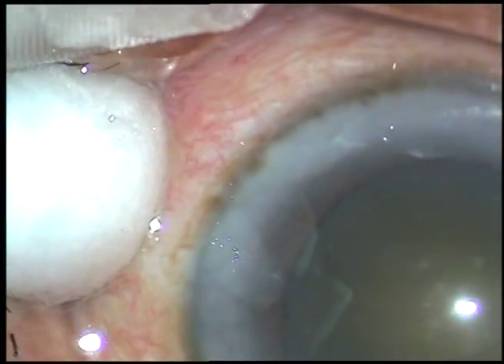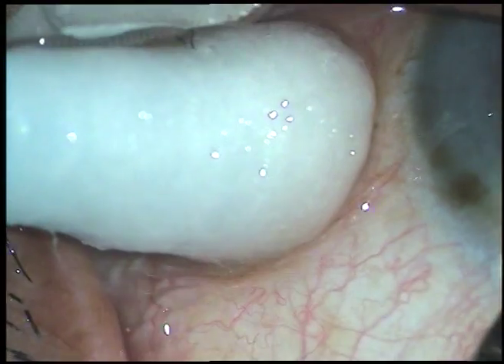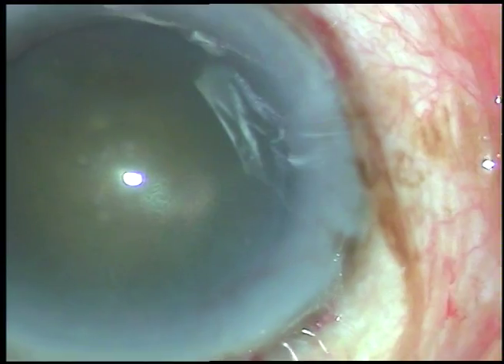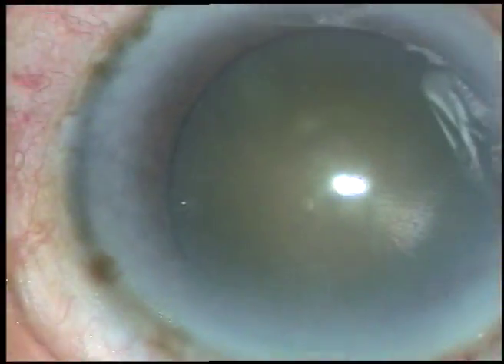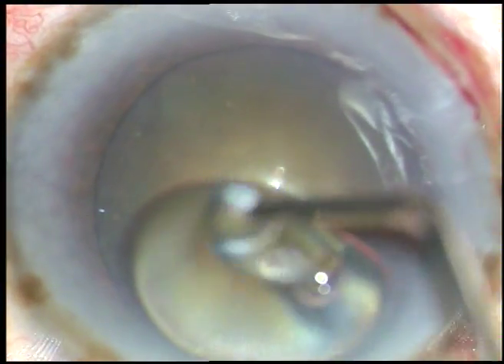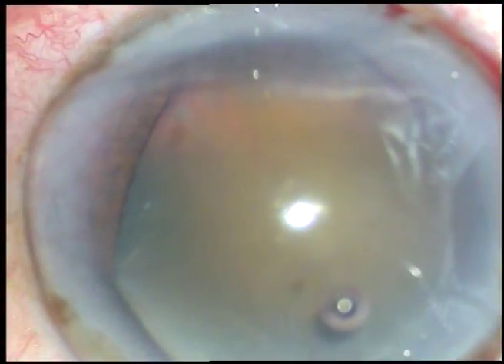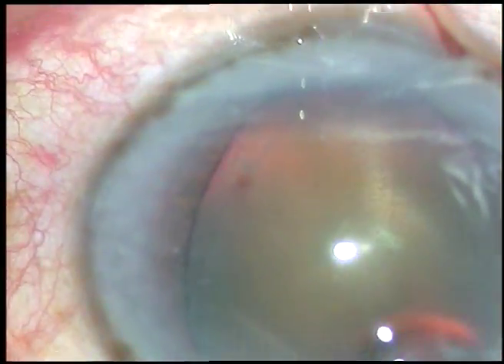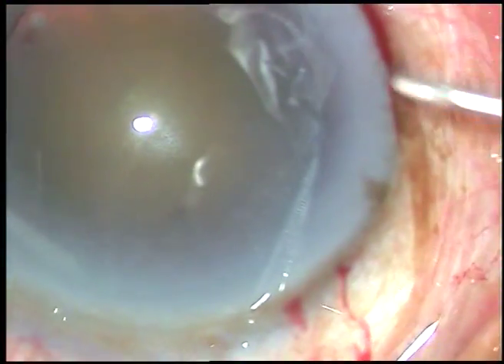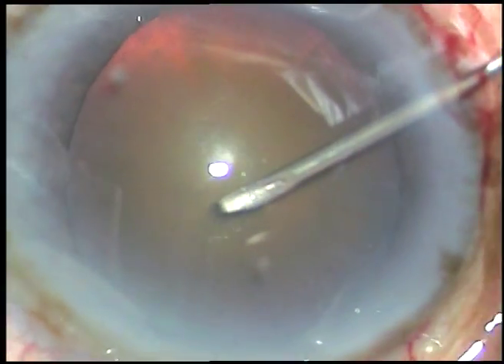Two side ports are made — one on the right side and another on the left side of the main incision. Now capsulorhexis is to be done. I use a 26-gauge bent needle to incise the capsule and raise a flap, then I use Utrata forceps to complete the rhexis.